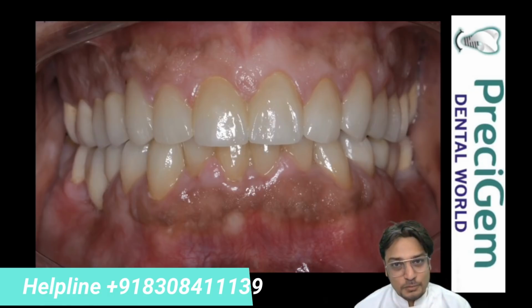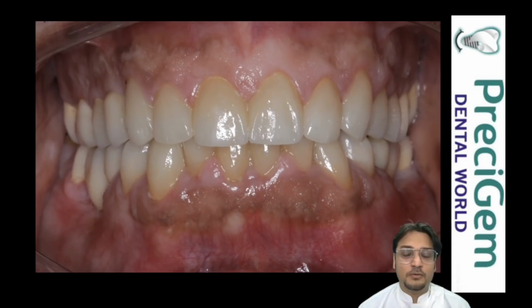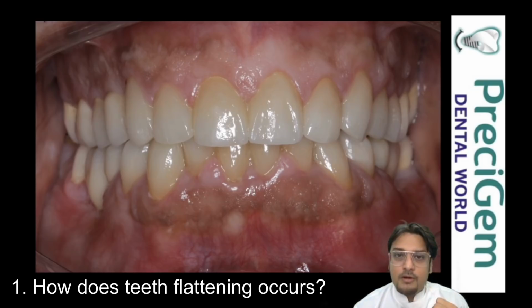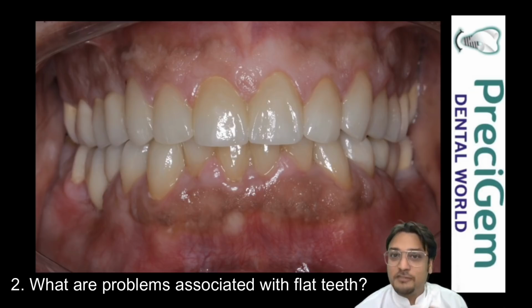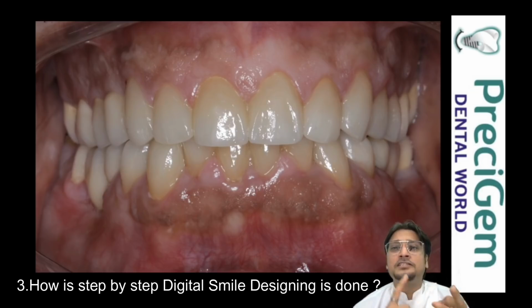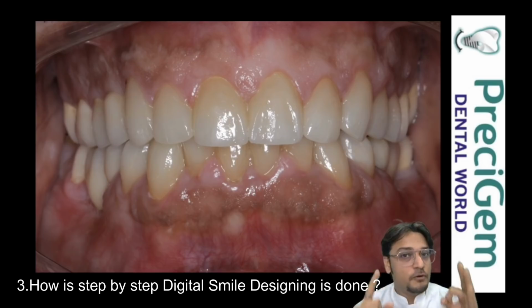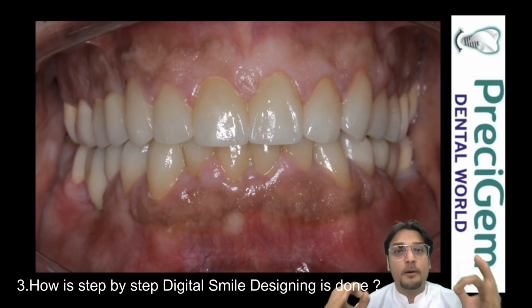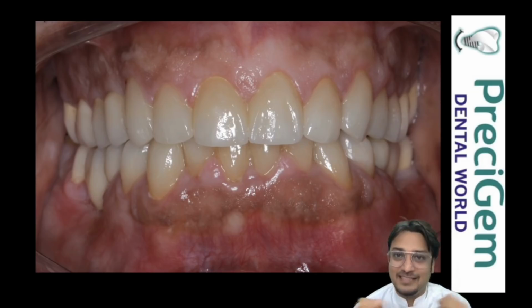And I, Dr. Mayur Khairnar from Precigem Dental World, in this video, am going to tell you 3 important points about flat teeth. Point number 1, how flat teeth happen in a normal healthy individual. What are the problems associated with flat teeth? And the step-by-step method of converting flat teeth into a beautiful set of teeth and a beautiful smile with the help of computerized digital smile designing.